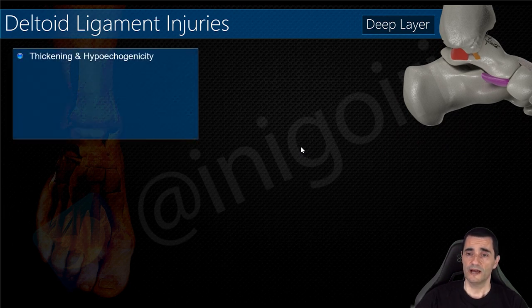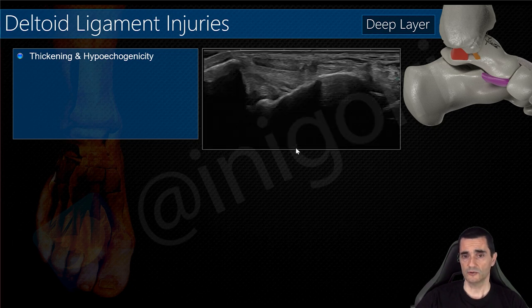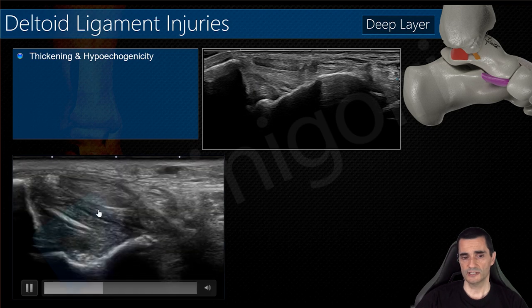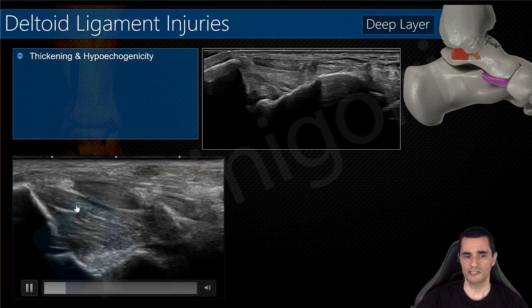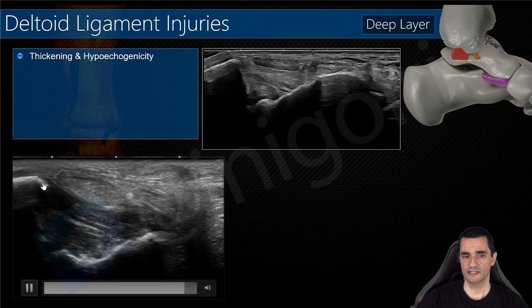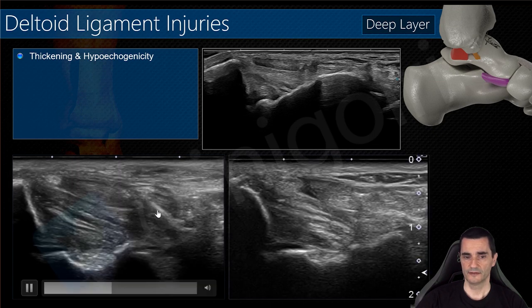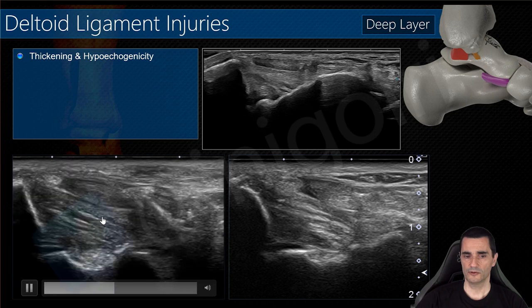Always with a ligamentary injury we will find thickening and hypoechogenicity of the ligament. The normal ligament shows a fibrillar pattern in the posterior tibiotalar ligament, with echogenicity very similar to surrounding structures. Always perform dorsiflexion of the ankle to obtain this image. In this case you can notice thickening and hypoechogenicity of the posterior tibiotalar ligament.